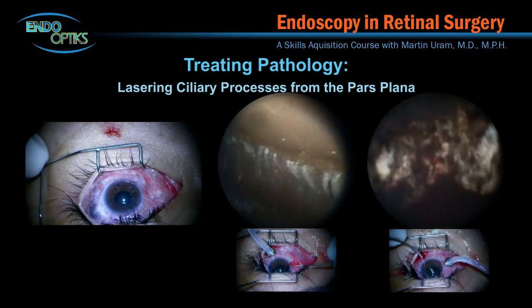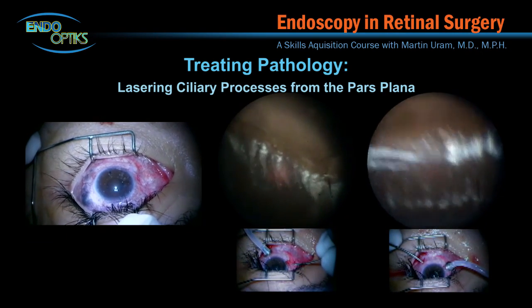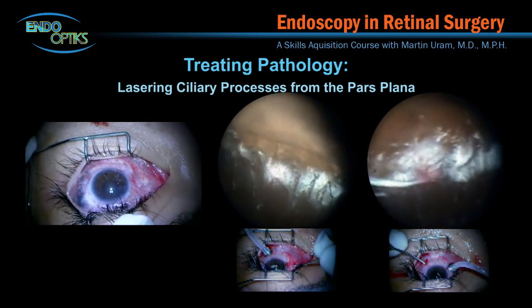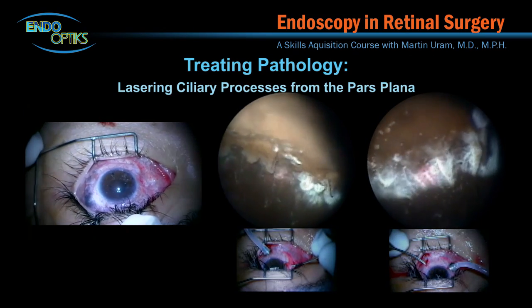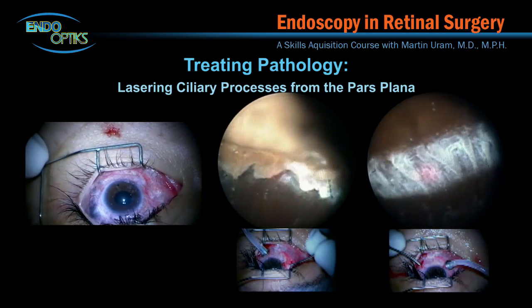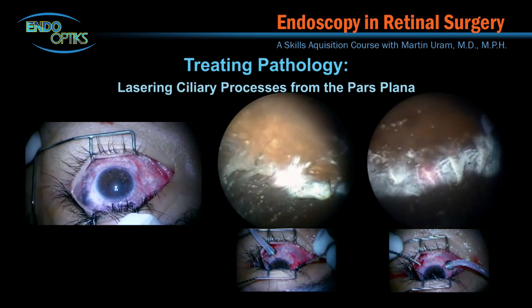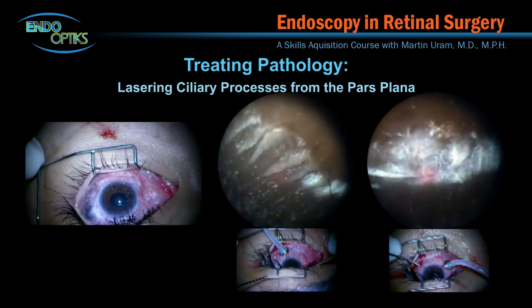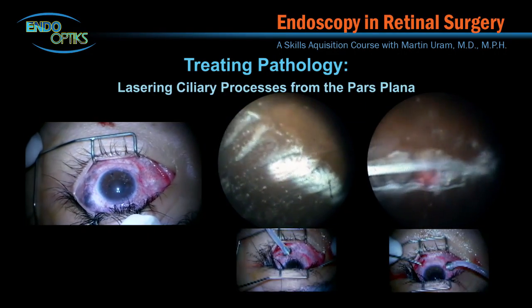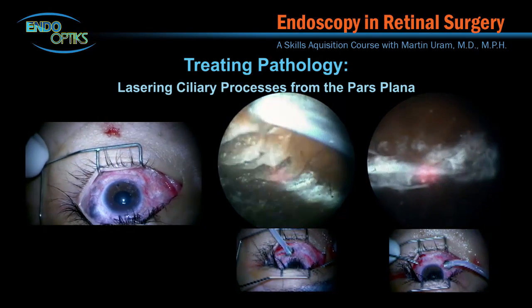This is an eye with multiple tubes, previous transscleral cyclodestruction, and repaired retinal detachment. Another outflow procedure would be highly unlikely to be successful. On the contrary, the relatively simple one-handed pars plana introduction of the laser endoscope can easily access the ciliary processes and laser them with a high potential for success and much smaller risk of complications compared to the other approaches available to this patient. Because a straight probe can only access 180 degrees of the ciliary processes, as in the center video, the infusion cannula and endoscope positions are exchanged to access the other half of the ciliary ring, as in the video to the right. Note the tube underlying the iris.